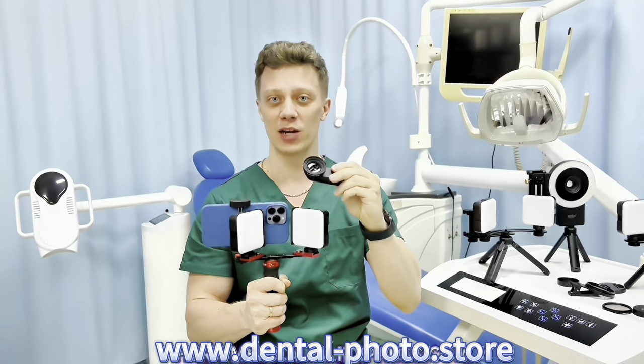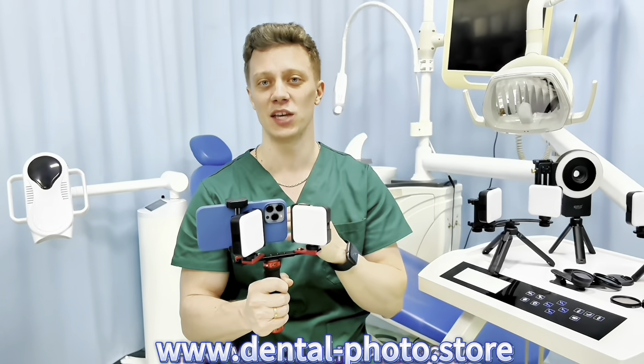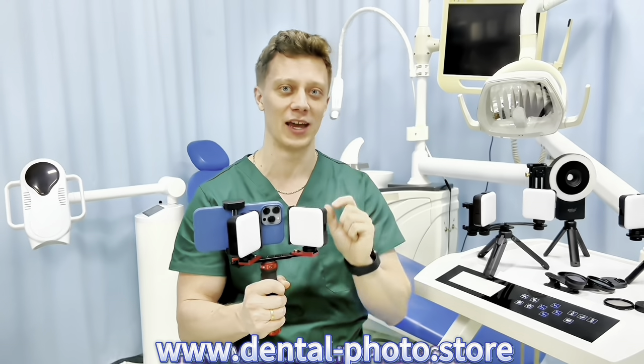Or you can order it together with the 100 millimeter macro lens. This is the newest macro lens that we developed in our company just for dental photography. The shooting distance is 10 centimeters, so now you can take photos of the molars. This lens is flat so you can take photos of all the teeth, not just a small area.